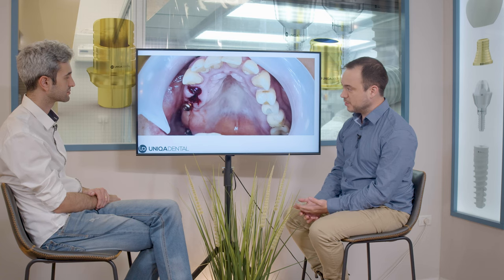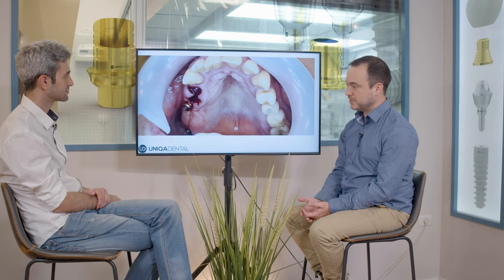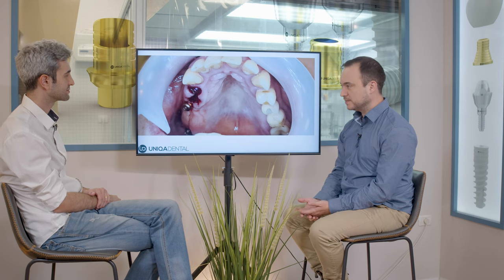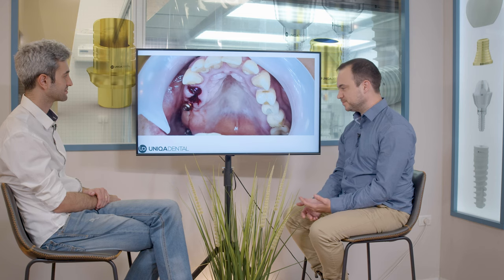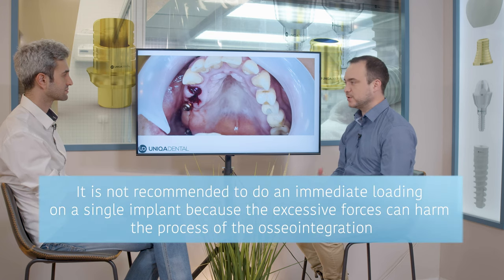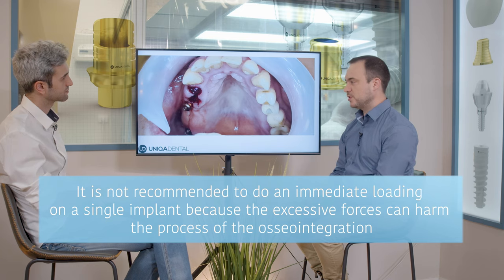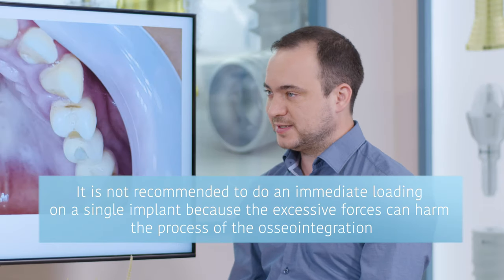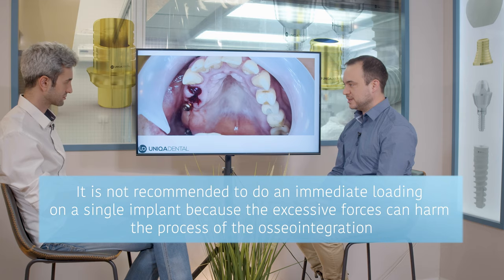We extracted both of the teeth and added an implant in the first premolar area. Because we have two osseointegrated implants, we can make a bridge on those three implants and use the new implant for immediate loading. In regular cases, it's not recommended to use one implant for immediate loading because excessive forces go on this implant and can harm the process of osseointegration.